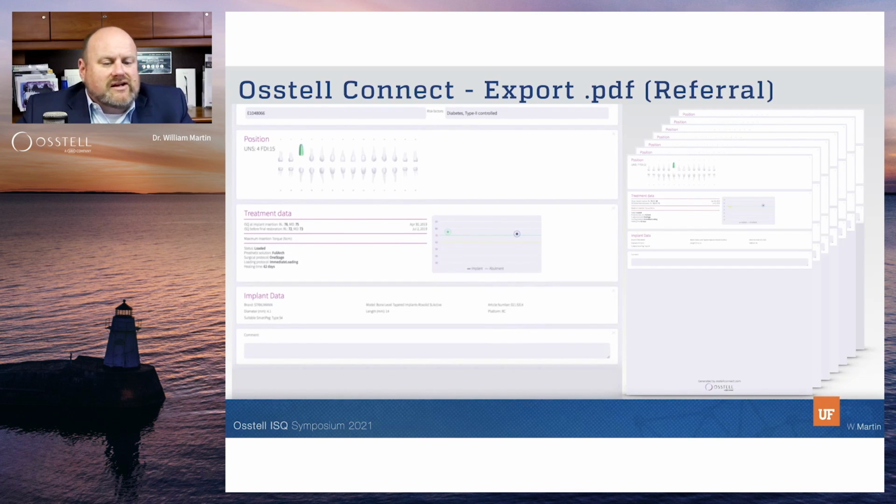This is the one thing that gets me really excited, because we have patients that come and go in our practice, and I always want them to leave with something that's going to make the following clinician have information to help them treat them better. And the reason being is we have so many patients that come to us that have no information on their implants, and the amount of time we spend researching that and figuring out what they have in their mouth is extremely frustrating.